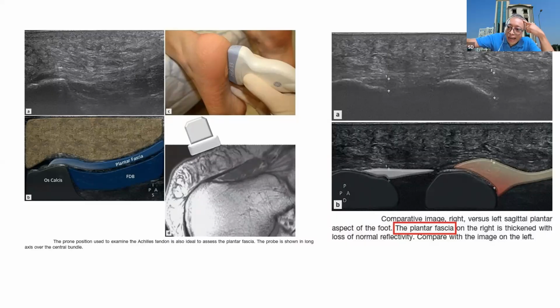So I have no idea. In Nepal, it's not available. So unfortunately, I have to use the lignocaine jelly. I'm sure you all have seen lignocaine jelly. That is one of the tricks. You can use lignocaine jelly. That is mostly sterile, cheap and sterile. And that's lignocaine jelly, it will not cause any damage to your probe.